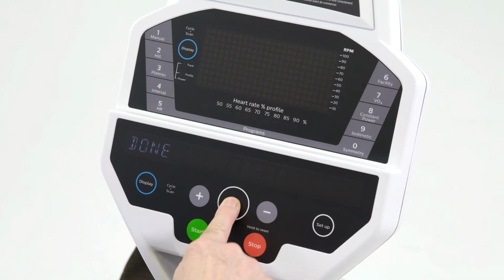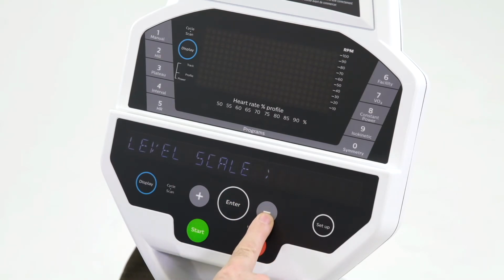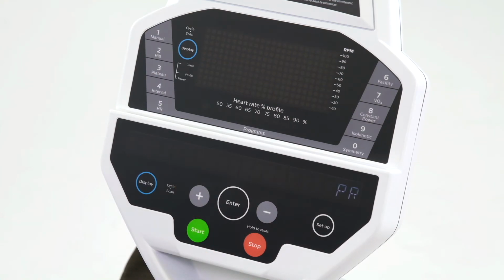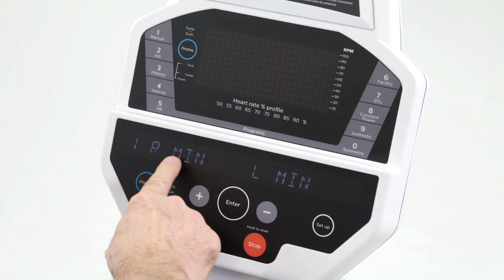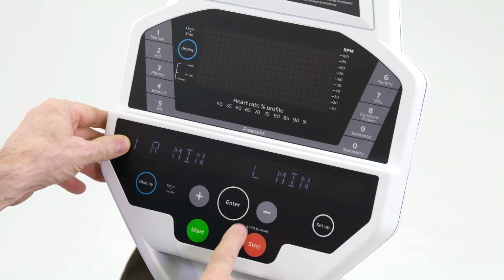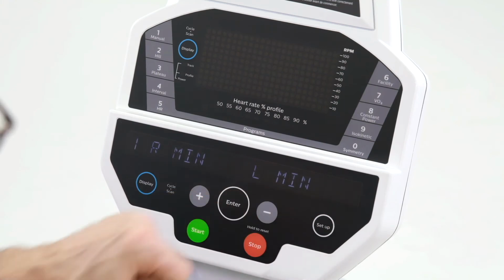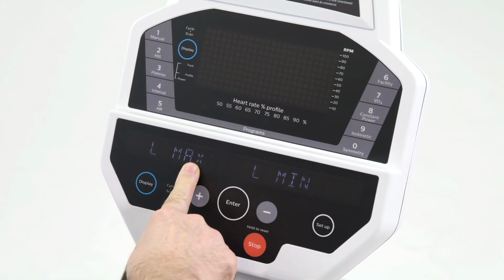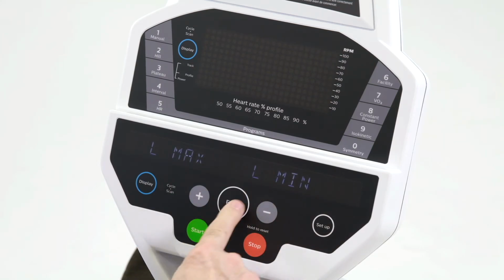So I'm done setting up all the patient data. Why don't we go to the seat position function. This function allows you to enter the patient information like we just did, the user's height, and then be able to enter the patient's minimum and maximum knee flexion. We have 6 settings for the knee flexion: right minimum, left minimum flexion, all the way up to left knee maximum. So we'll do that one.